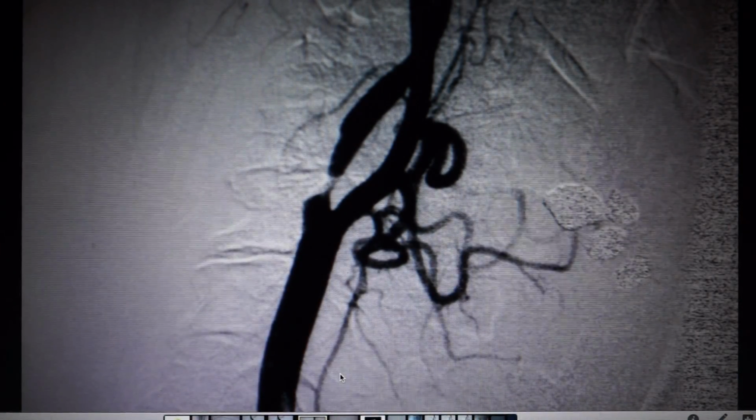Another part of the issue is that it's often difficult to tell where the lesion is after the angiogram is done. Here's an angiogram where the stenosis is clearly visible. However, during the fluoroscopy, the lesion is not clearly visible, and it's difficult to determine where the wire should go and the balloon should go. And VesselSizer will help with this problem.